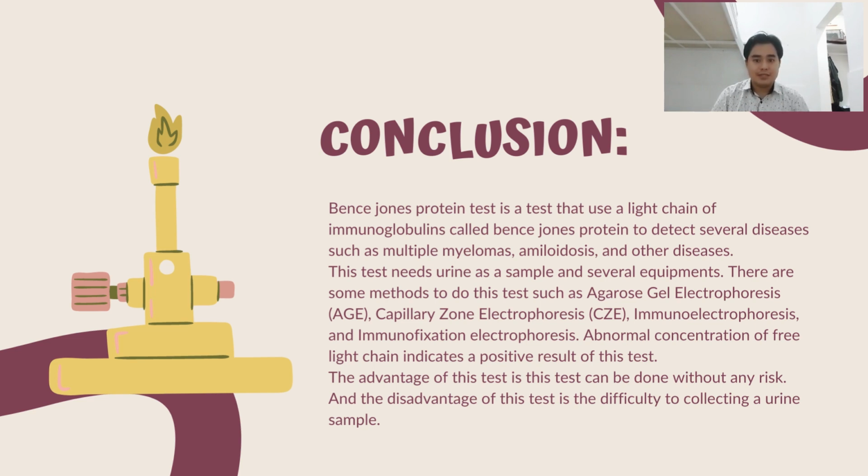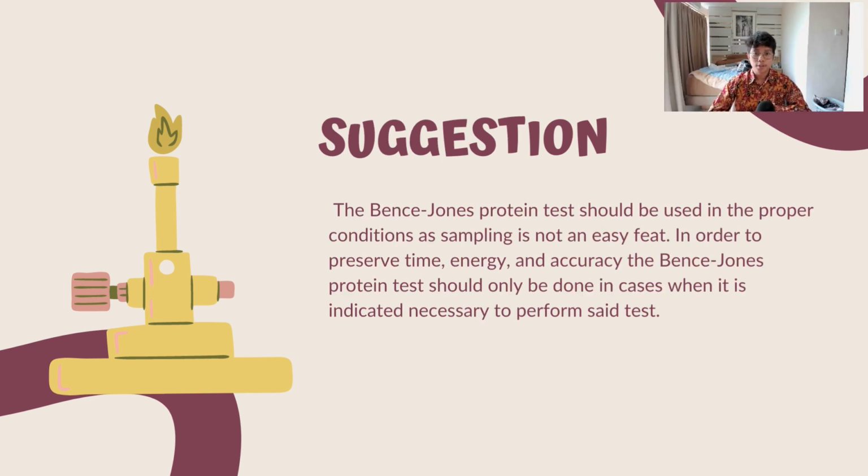The advantage of this test is that there are no risks, and the disadvantage of this test is that urine samples are difficult to collect. So for the suggestion, the Bence-Jones protein test should be used in the proper conditions, as sampling and analyzing the sample is not an easy feat. So in order to preserve time, energy, and accuracy of diagnosis, the Bence-Jones protein test should only be done in cases when it is indicated necessary to do so.